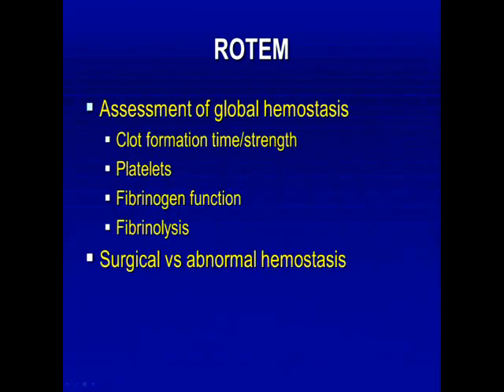It does give you information about quantitative platelet function, not so much qualitative platelet function, which I'll talk about later. That's one of the downsides to the test. And it gives you an idea about fibrinogen function in terms of quantitative levels and also the function of fibrinogen. And one of the neat things about Rotem is it gives you quantitative data about fibrinolysis, which most tests traditionally haven't really given you much data, or they were very difficult to interpret.